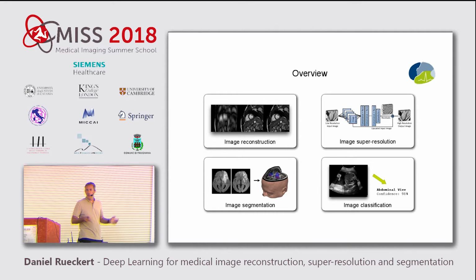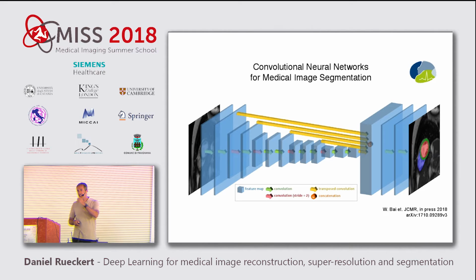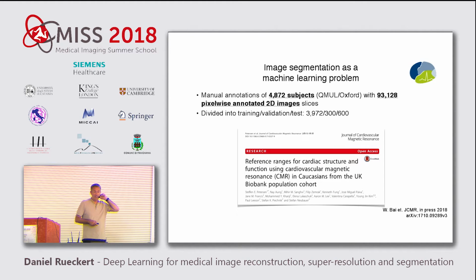And you might say, well, we've learned almost everything about segmentation, semantic segmentation. I've showed you already an example. I just need a simple network like a fully convolutional network or UNet, and a lot of training data. I showed you this particular case from UK Biobank where we had 5,000 subjects, nearly 100,000 2D views. If you apply your network to this data, it works really well.